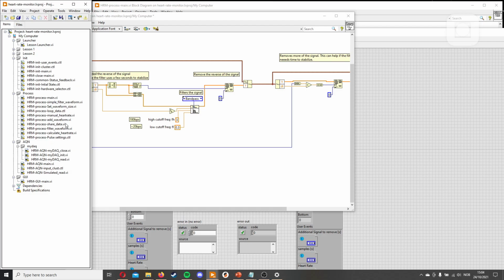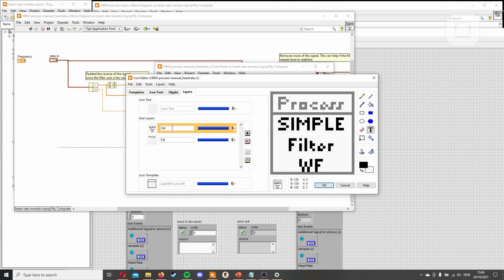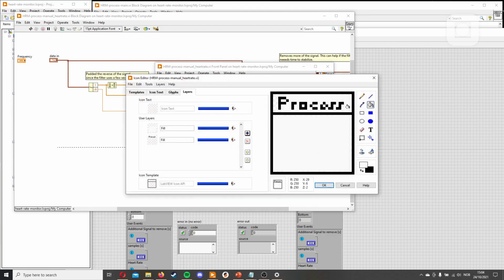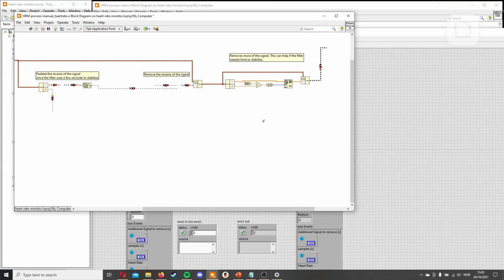Let's go back to our manual heart rate. Add the double out. Frequency out. Waveform in. And let's change the icon before we forget that. Manual heart rate. Now we almost need to delete everything in here. We can keep a few things.